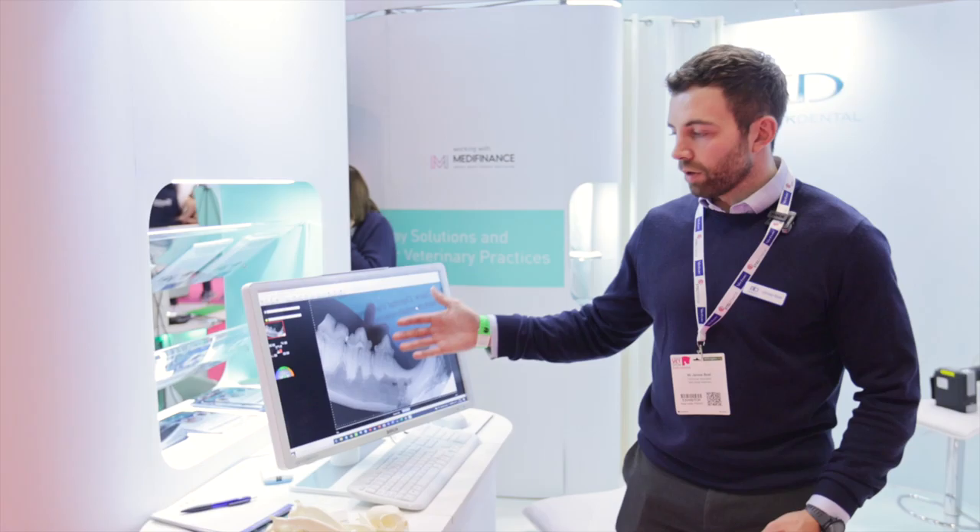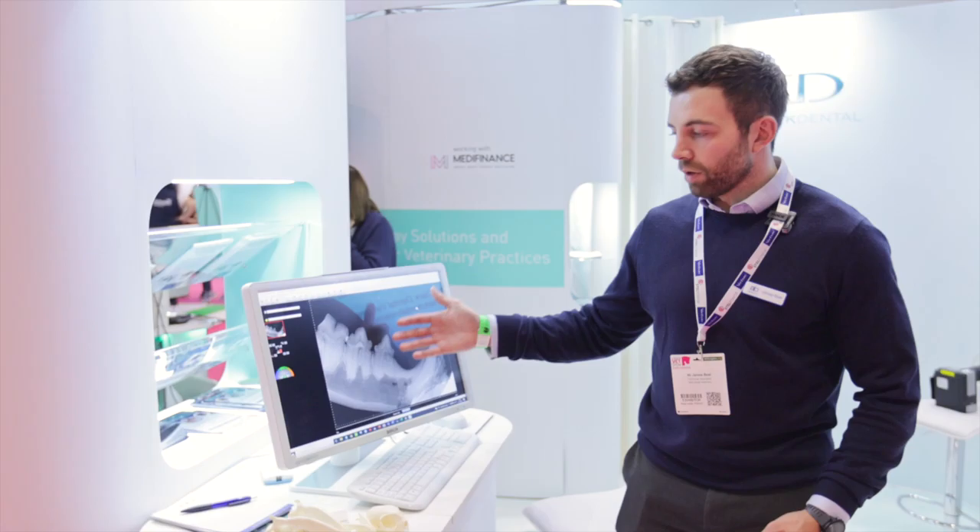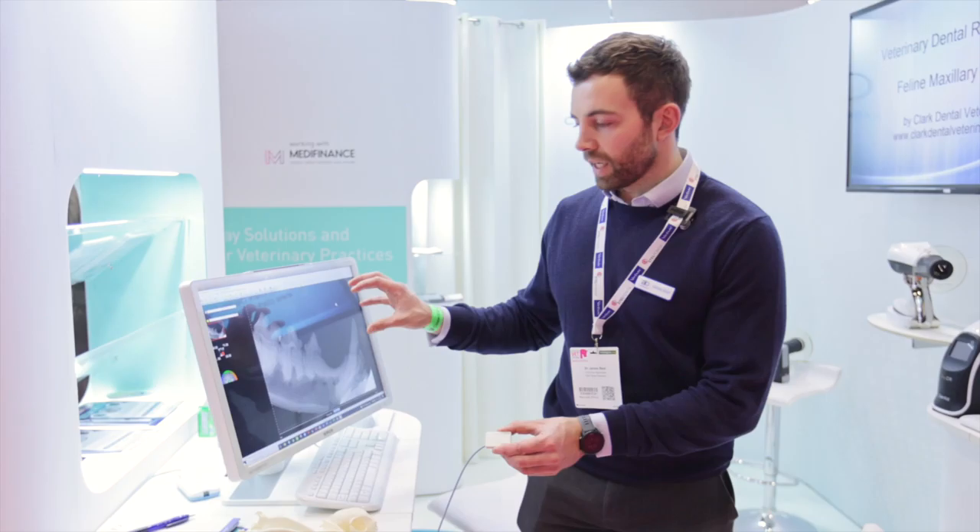Here we have the Zara Supreme DR sensor, which is used for dental radiography. It supplies fantastic, market-leading image quality — 33 line pairs per millimeter. And what makes this different to other sensors in the market?